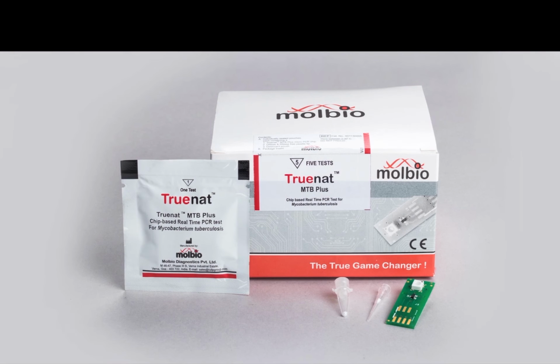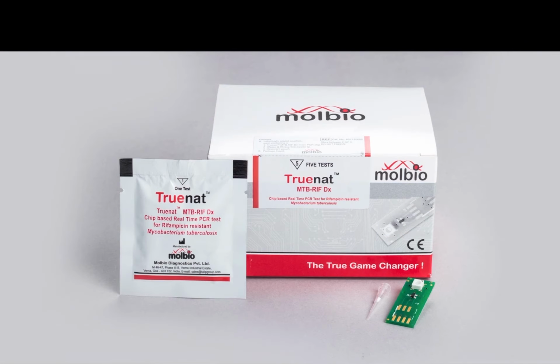Then we have the more sensitive MTB plus chip. Both MTB and MTB plus do the test and tell us MTB detected or not. Once MTB is detected, we want to know the RIF resistance status. So the MTB RIF chip tells us whether rifampicin resistance is detected or not detected. These chips will be given in low quantity, so you have to be careful.